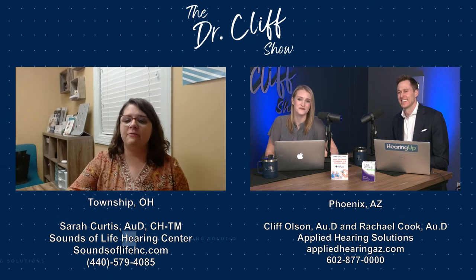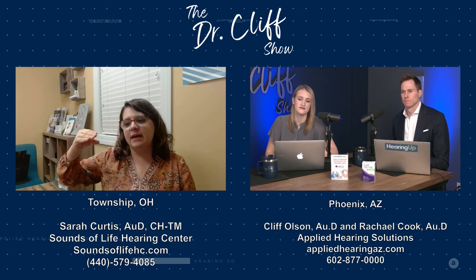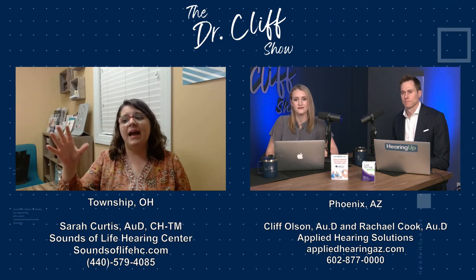And one of the things I've realized, and Cliff, I don't know how many ear molds you guys fit in your practice, but there's a certain point in a hearing loss that domes just do not cut it. Mm-hmm. And I see those patients walk in my practice all the time. We test them and we look at their audiogram and we say, I'm sorry that your old practitioner decided you didn't need ear molds, but I will not refit you. You will not pay me for real ear measures until we get an ear mold on those hearing aids, because it's not even worth your time.